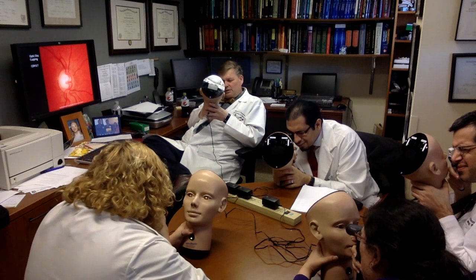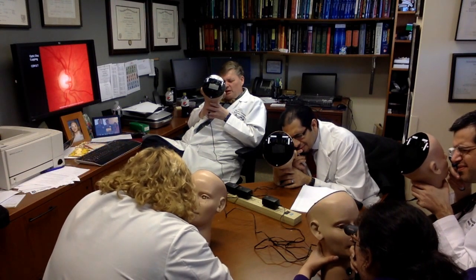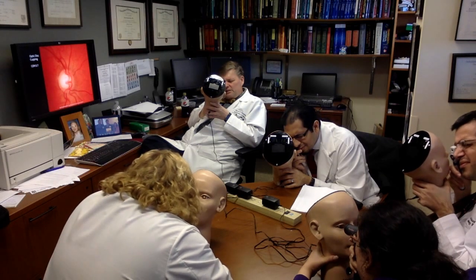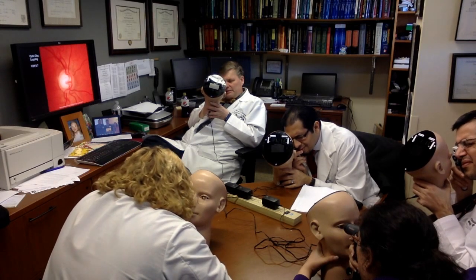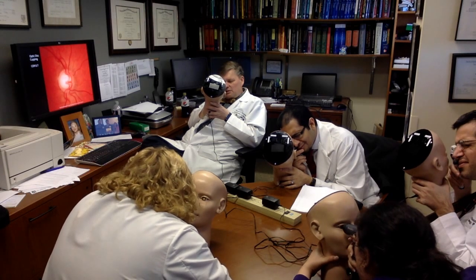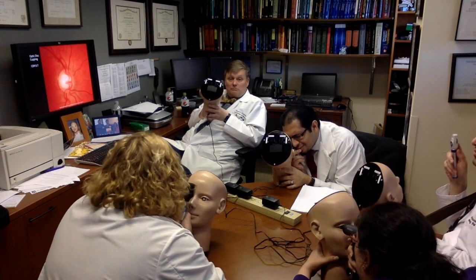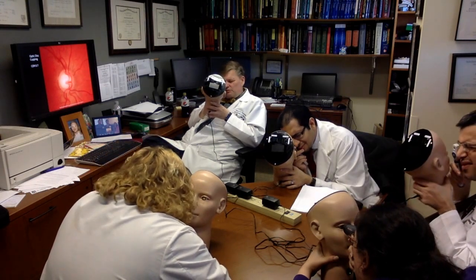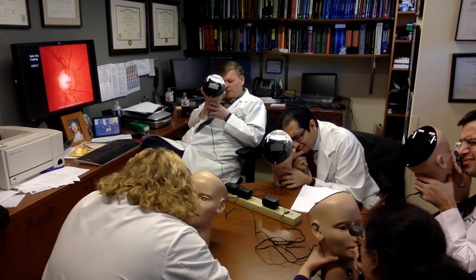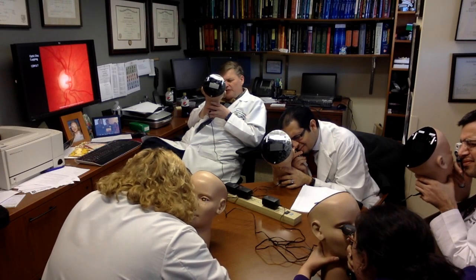You get closer, closer. As you get closer, gently turn your wheel and focus in on the retina and see if you can find the disc. Can you see the disc? Is it weird that I don't have to turn the wheel? It's not weird. It just means you're in focus. Okay, that's fine, just focus as best you can. Does everyone see the disc? Yep. Good. Now let's look at the veins first.